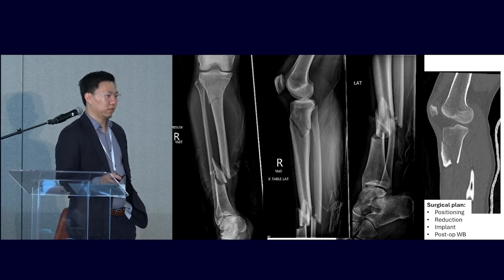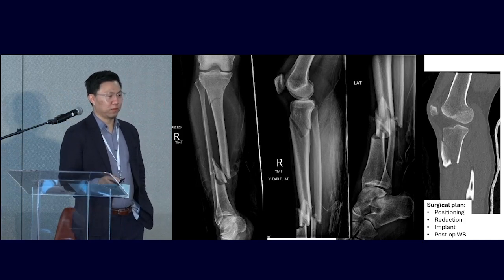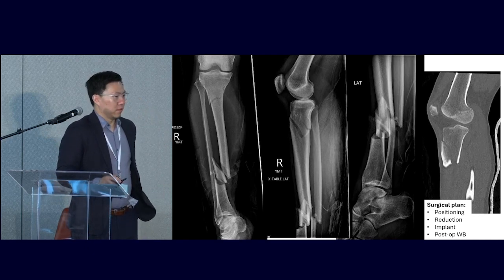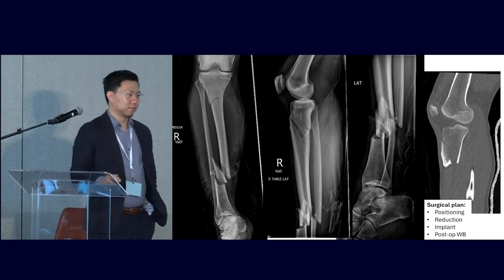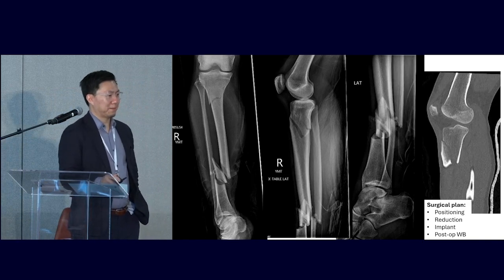It's funny, we do reamed nails in almost everything, but when I was a resident, we did unreamed nails in almost everything. I said to the residents, there's no law that says you have to ream. So I would not ream that middle segment of this fracture. I think there's a big enough canal. Sometimes the lateral gets a little tight. And I think in the SPRINT trial, Emil Schemitsch stated, I know Emil's not here to speak for himself, but said a one-pass reaming gives you that paradoxic increase.